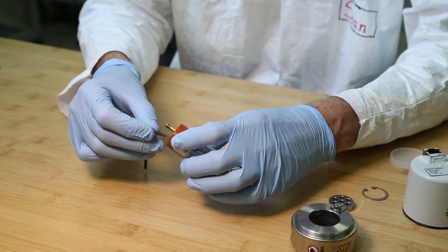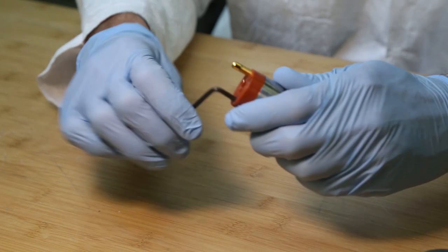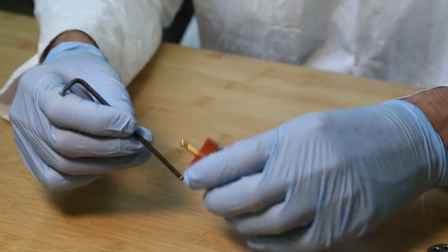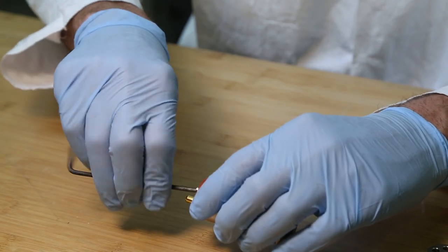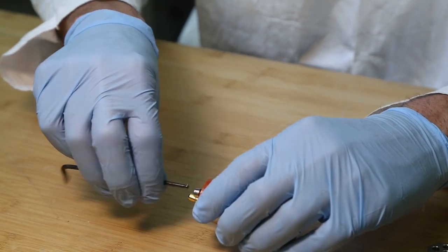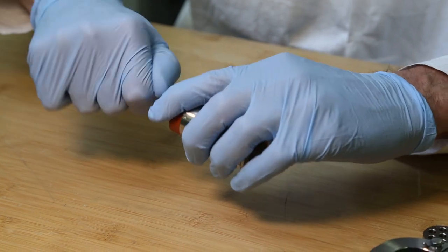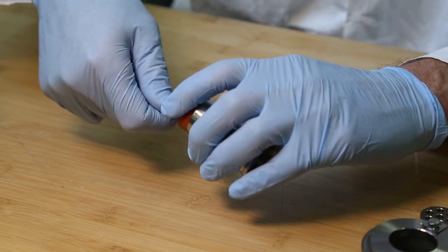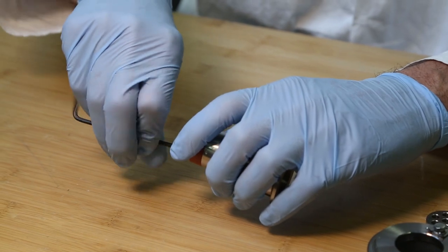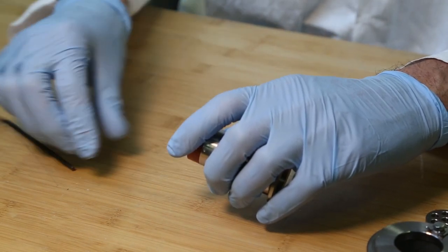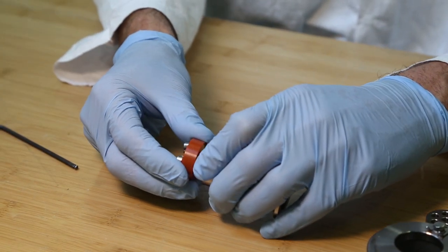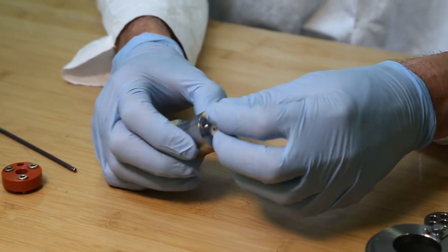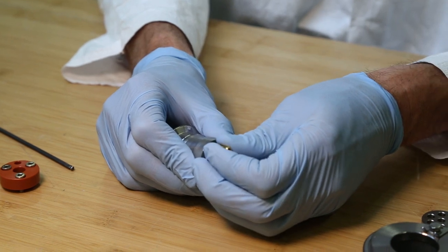We're going to remove the orange cap. There's three screws here. Take the orange cap off. So we have, in this case, the Pirani tube just pulls out. There's an O-ring there.